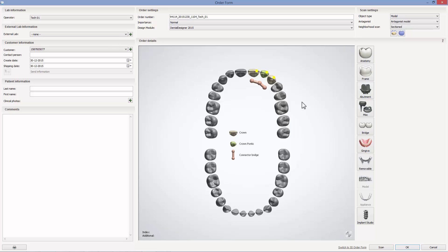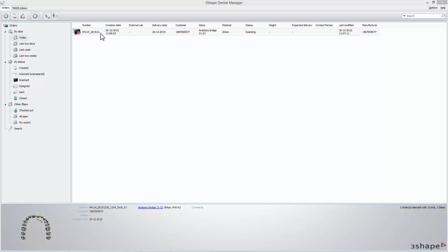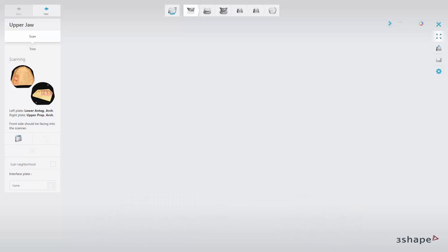When you want to start the scanning process, first open ScanIt Dental. You can do this either by clicking the Scan button at the end of the creation of a new order, or by double-clicking the selected order in the Dental Manager.